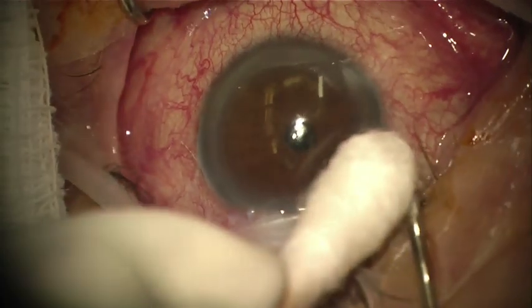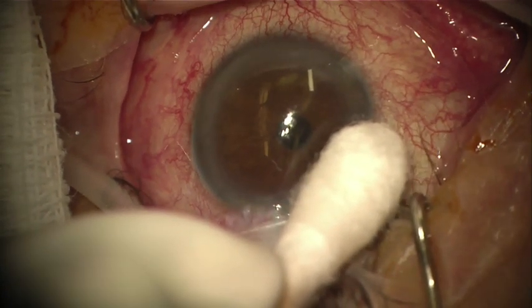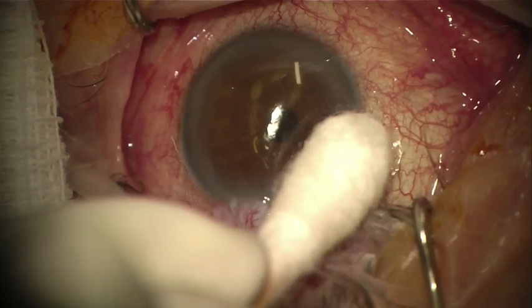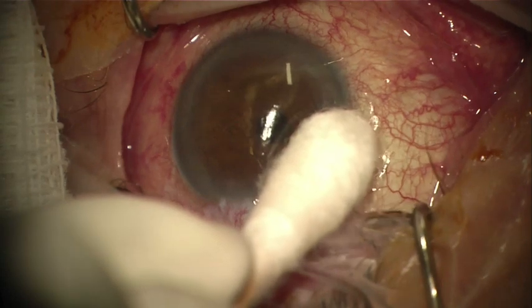If you remove the tip too quickly, the implant can follow the egressive aqueous and get lodged in the incision site. I follow this step quickly with tamponade of the incision site with the cotton tip.